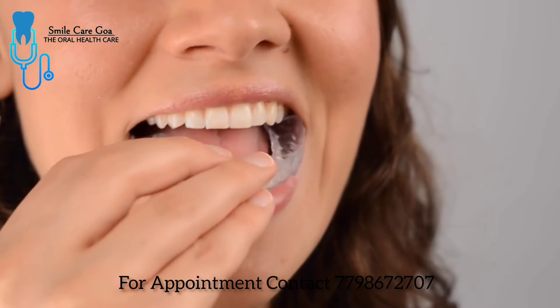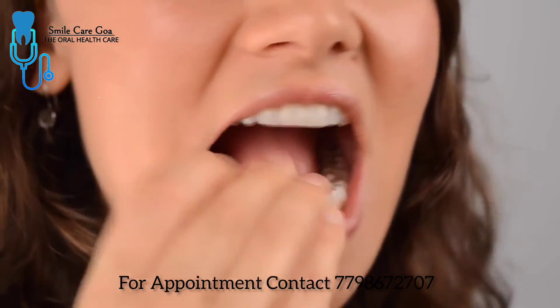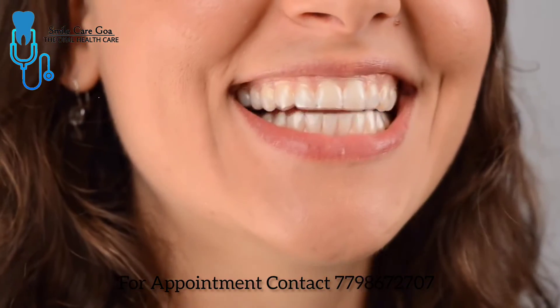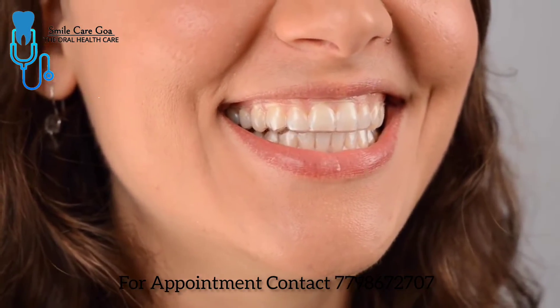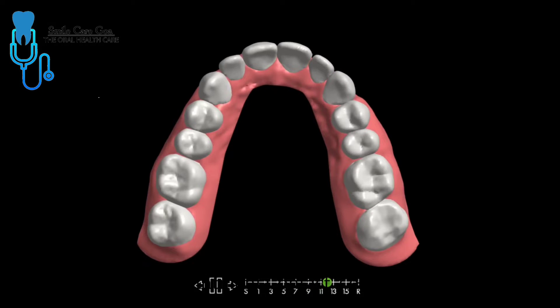The patient snaps the aligners onto their teeth and wears them all day and all night, taking them out only to eat, drink, and brush their teeth. The aligners are clear, so most people don't even notice them. Each aligner applies light pressure to certain teeth, pushing them closer to the desired position.